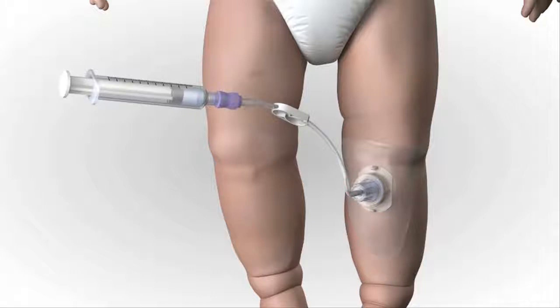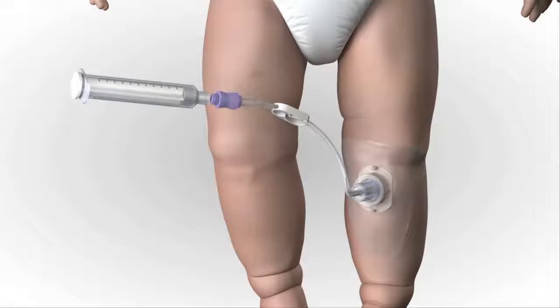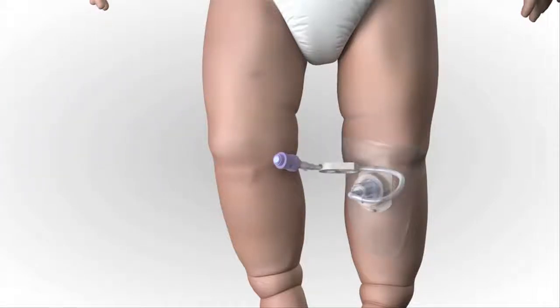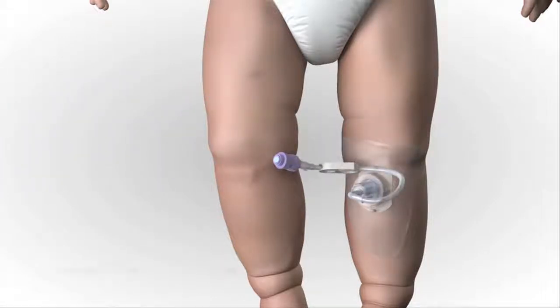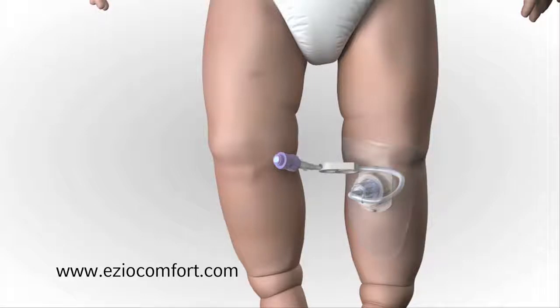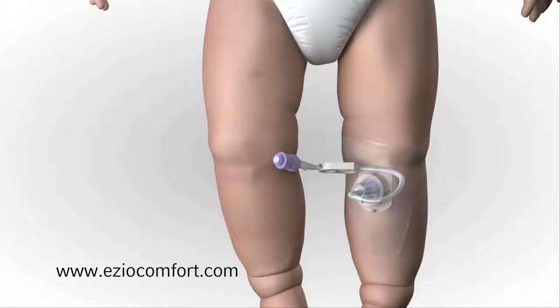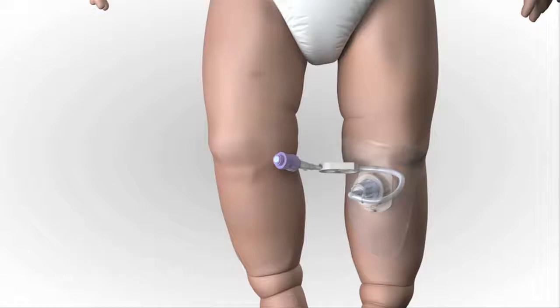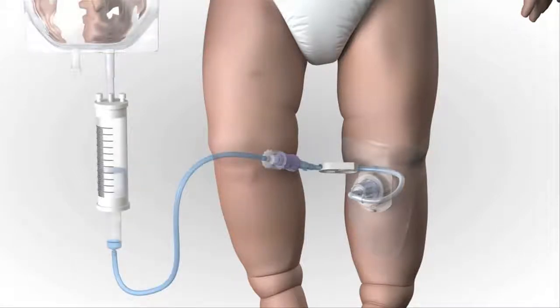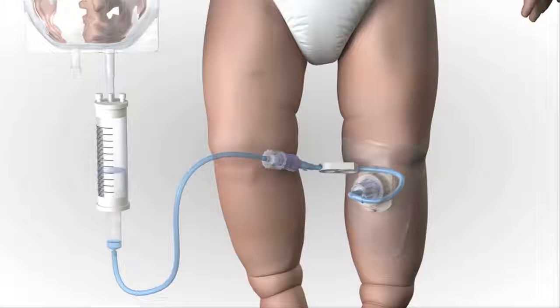Flush the catheter with 2 to 5 milliliters of normal saline. For patients responsive to pain, please visit www.eziocomfort.com for additional information. Connect fluids if ordered. Infusion may need to be pressurized to achieve the desired rate.